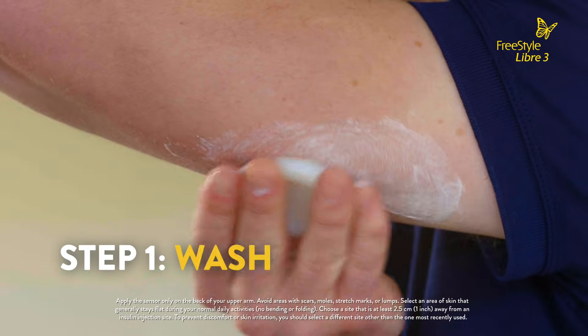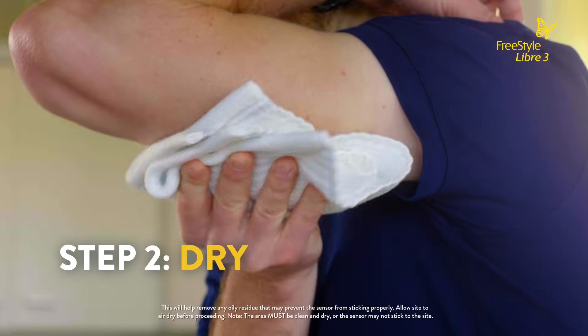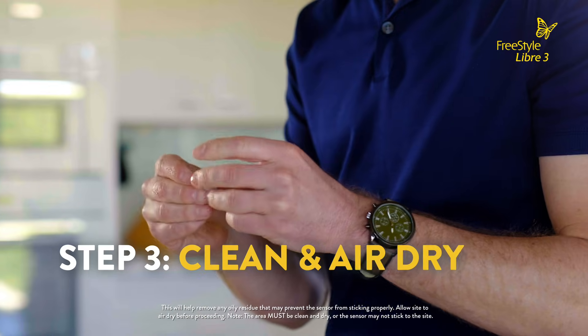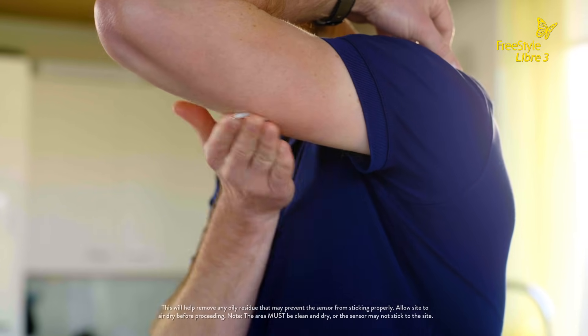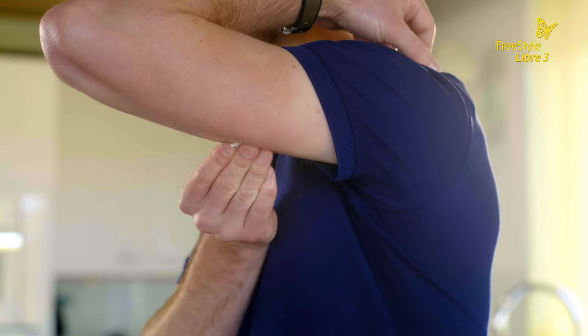Wash the back of your upper arm using a plain soap and water. Wipe dry with a clean towel. Clean with an alcohol wipe and then let air dry. Following these three easy steps helps ensure the sensor stays on your skin.